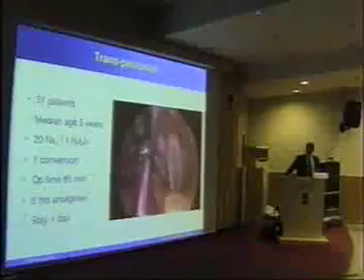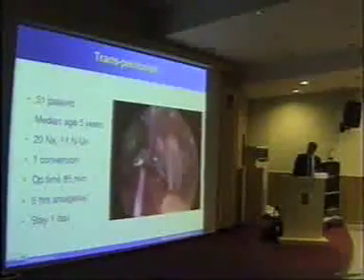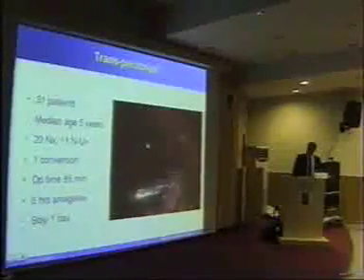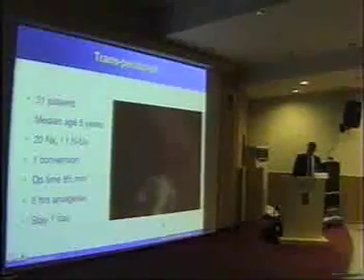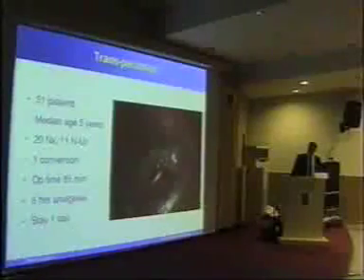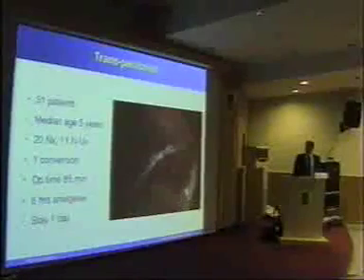And this is a nephroureterectomy going right the way down to the lower end of the ureter. We're looking down into the pelvis. The bladder's on our right, and this is the vas, actually in this fold of tissue here. And this is the kidney and the ureter going into the basket. There we are, there's the ureter. And zip it up. I love that instrument. Okay.